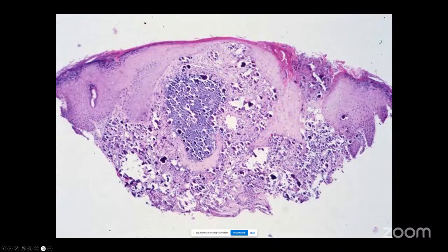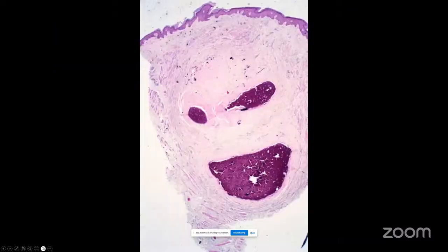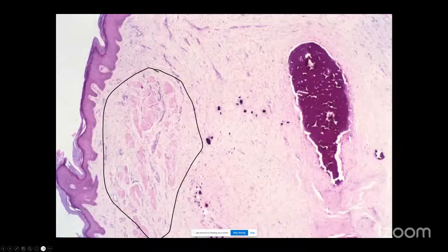decide that. Here, massive calcification pushing up against the epidermis. The epidermis is sort of surrounding it with a collarette. This is subepidermal calcified nodule. You usually see it on the head and neck area, especially in kids and young people. Here you have, again, calcinosis cutis with surrounding fibrosis. It's almost sort of annular. If you look here, you can see where we have dartos smooth muscles.